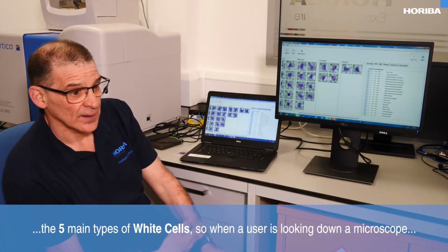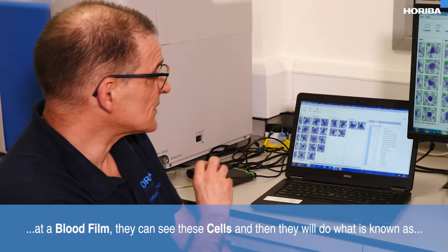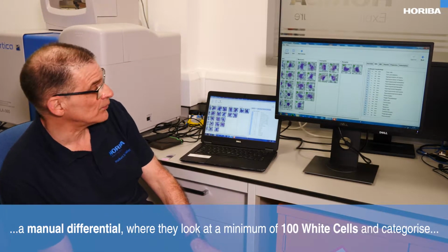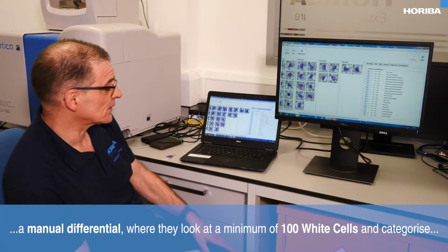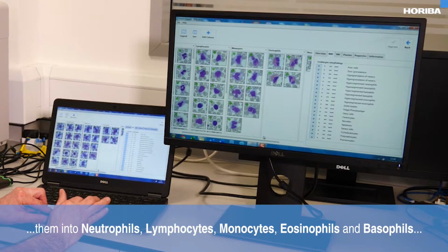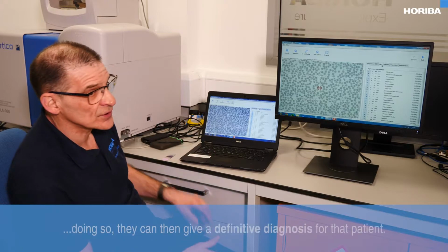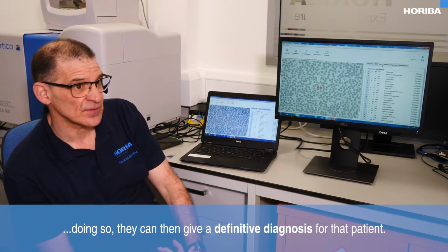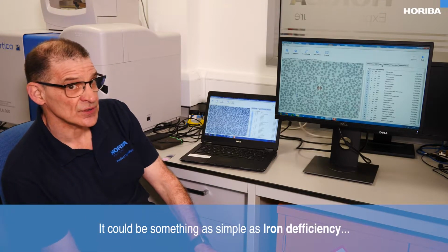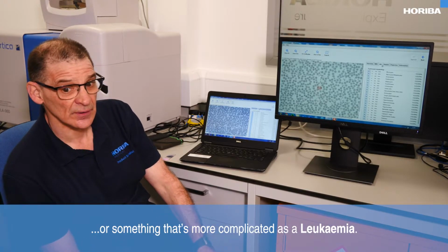So when a user is looking down a microscope at a blood film, they can see these cells, and then they will do what is known as a manual differential, where they look at a minimum of 100 white cells and categorise them into neutrophils, lymphocytes, monocytes, eosinophils and basophils, and also look at the red cells. And in so doing, they can then give a definitive diagnosis for that patient. It could be something as simple as iron deficiency, or something more complicated as a leukemia.